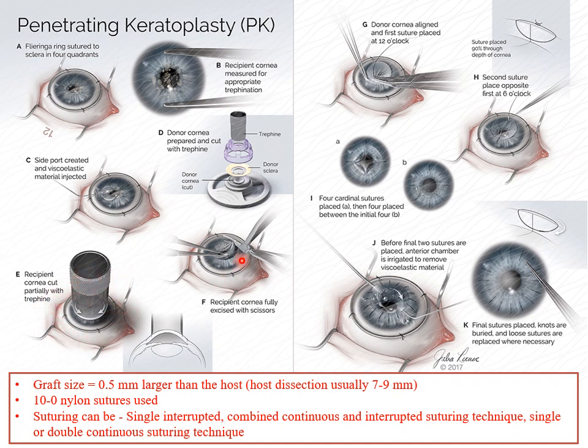After the partial trephination, it is lifted from one side and the Castroviejo corneal scissors are used to complete the dissection all around. So this is where you have to take care of any anterior or posterior synechiae that may be present, and you have to take care of avoiding damage to the underlying structures such as the lens capsule, iris, and so on.